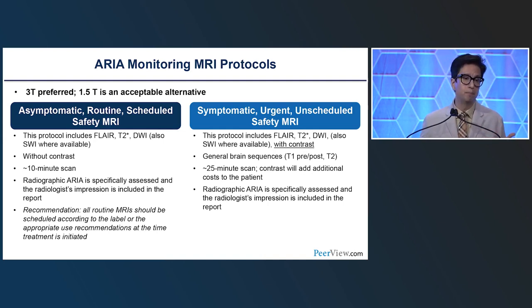And in our practice, we get both. We get susceptibility-weighted imaging and gradient echo because sometimes you'll see vessels in profile with SWI that can be confusing, and then the GRE can help you delineate that. It's a 10-minute scan overall, and that's important because in monitoring individuals, you may want to pare down your protocol to prioritize the FLAIR and the susceptibility-weighted imaging so you can reduce your scan time and still do these assessments.